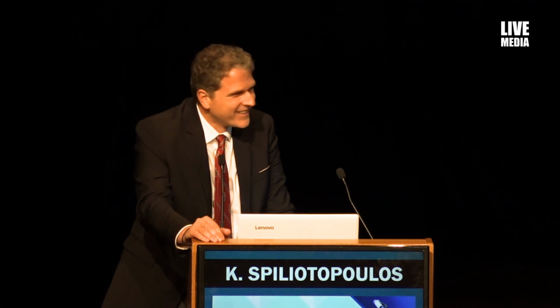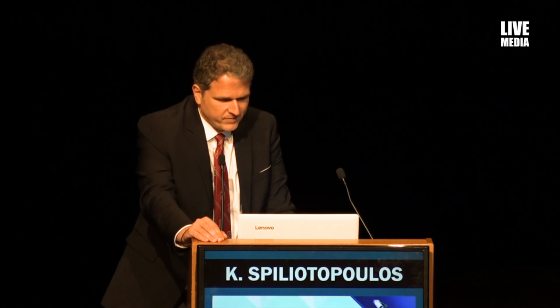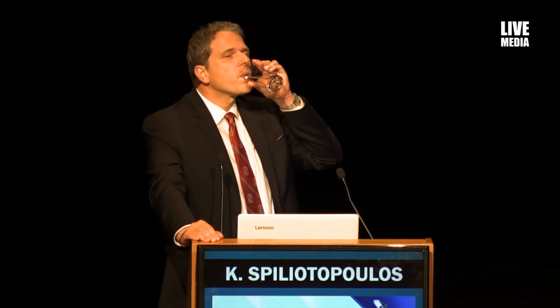No, I think every now and then we have a case like this. This is a typical case. We thought that we had good chances to do it from the leg. And if you notice, the angiographic appearance was not forbidding. Only when you see the CT scan screening, you get disappointed, because the angiographic appearance when we started the procedure was promising, but the CT always wins at the end.